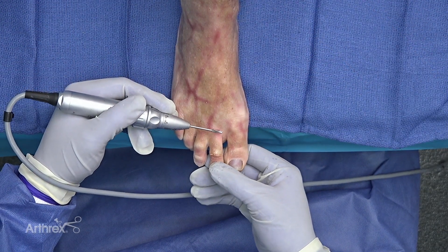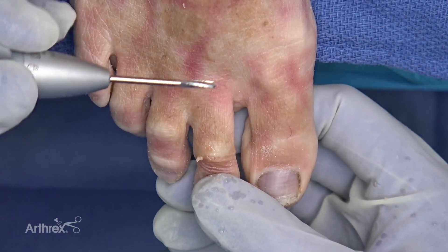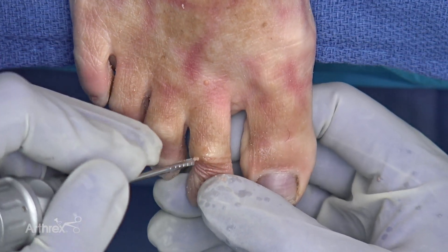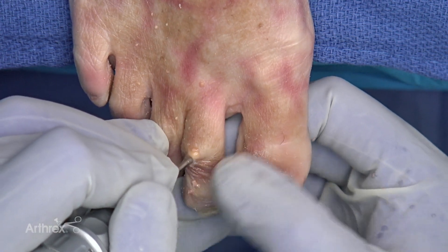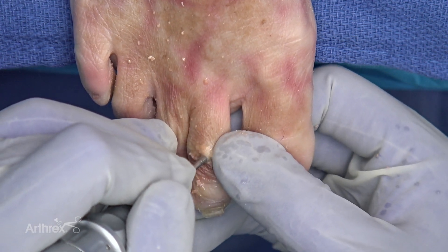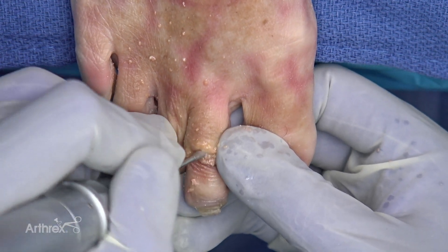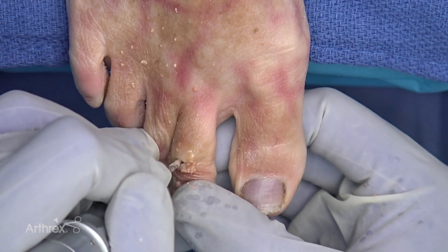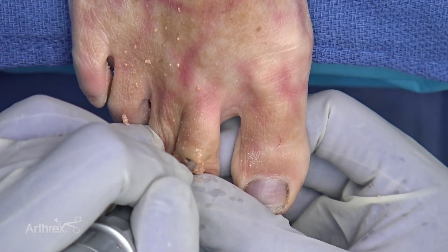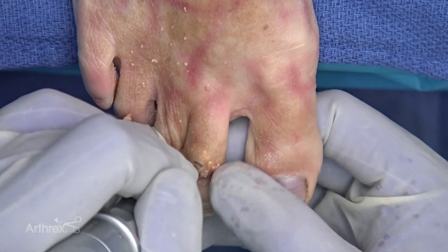Next we're taking the 2.9 millimeter wedge burr. The wedge burr is different than the Shannon Burr in that instead of cutting bone it's actually designed to remove bone. We're going to remove bone from both the proximal phalanx with some gentle pressure and a sweeping motion with a little bit of rotation, and then remove bone from the middle phalanx with a little distal pressure, a sweeping motion, and a little bit of rotation.